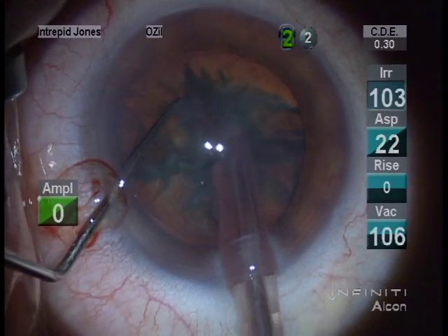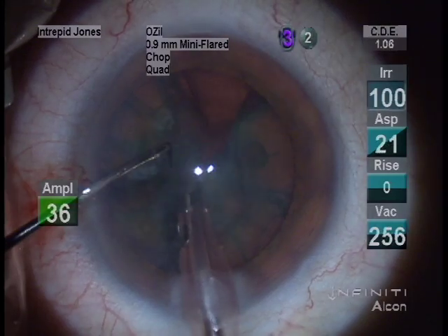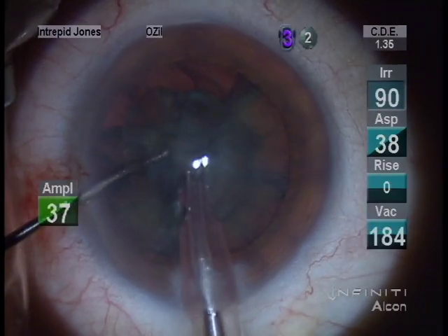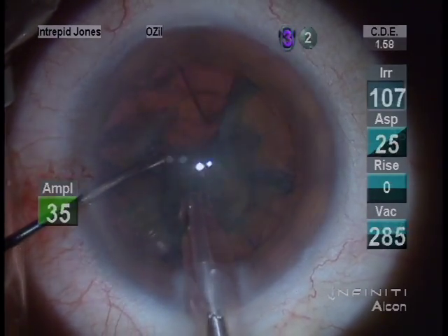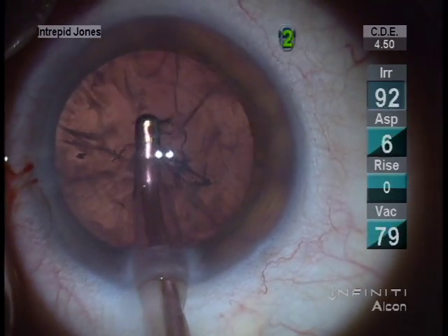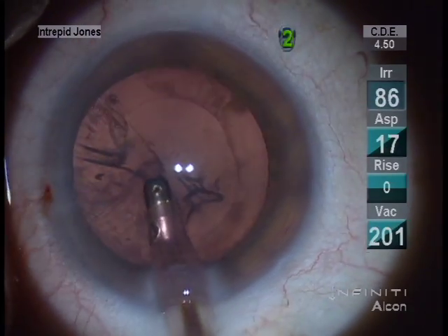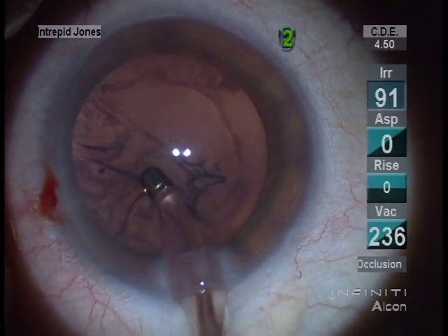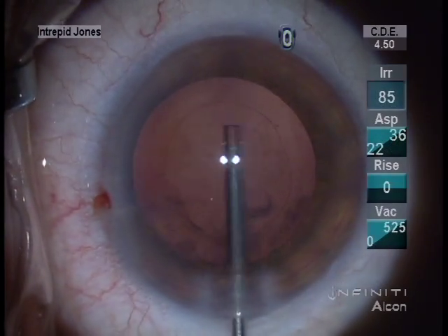I employ a CHOP procedure to remove the lens, and I like to work deep within the anterior chamber and capsular bag in a sequential fashion. If any small pieces or chips have floated up to the endothelium where the Viscoat is still maintained, as long as they do not obscure my view, I leave them in place as this maintains more Viscoat.